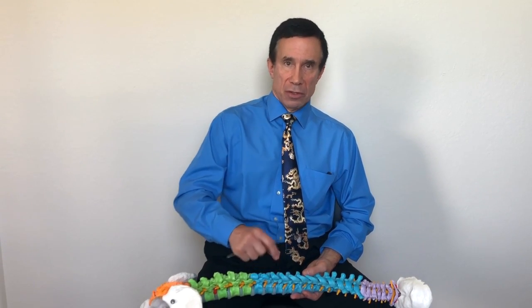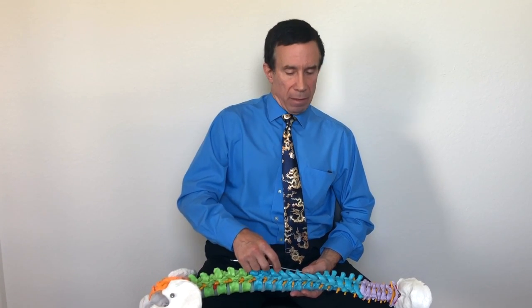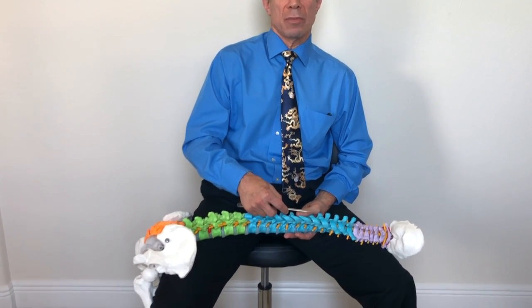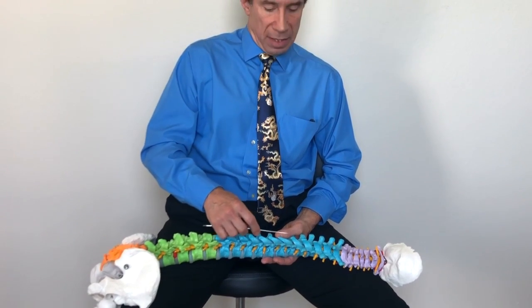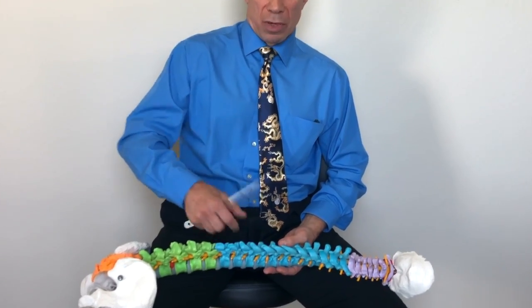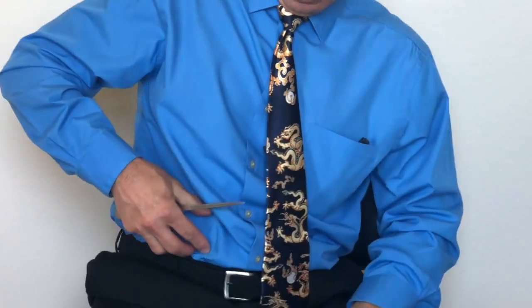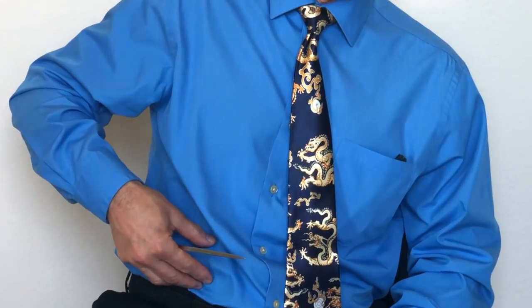The electrodes that are placed are much larger and wider and more efficient than the small electrodes that are placed and used during a trial. The implant is done typically under heavy sedation or sometimes general anesthetic. There's a connecting cable that is then attached to the electrodes that runs around the patient's side, and a pocket is made in the front under the skin in which a battery or a generator is placed.